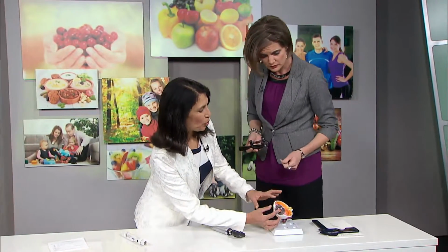And to dilate it, to make the iris draw back, you put drops in the eye, right? I do. And that stays like that for several hours? Yes, and we use the shortest acting ones, but usually it lasts for 2 to 4 hours.